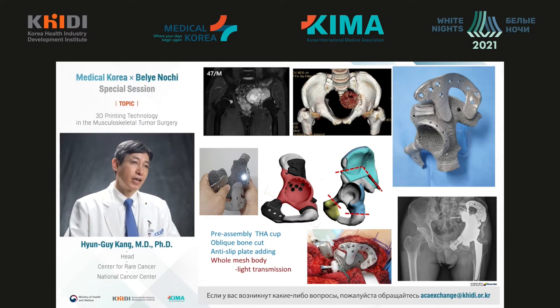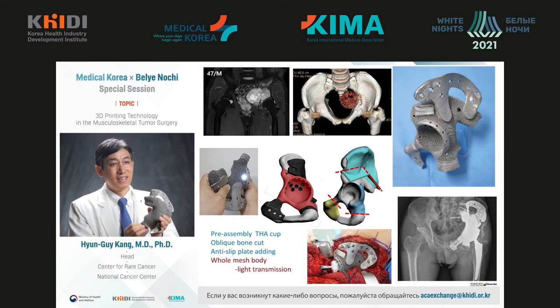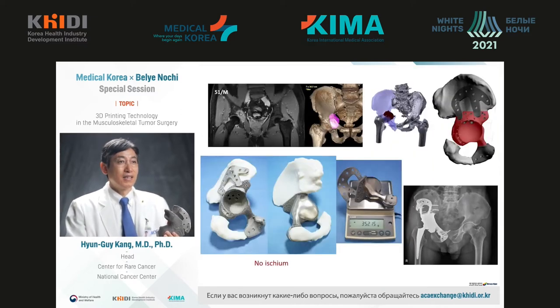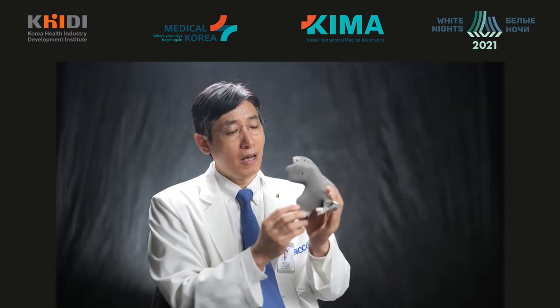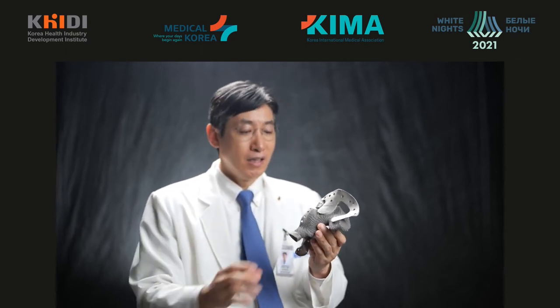Now I would like to show you some examples, starting with the pelvis. A patient, 47 years of age, with left pelvis chondrosarcoma. We printed a 3D implant with a whole mesh body. It should fix the pubic bone and ischial bone. The next patient, 51 years of age, had right pelvis osteosarcoma. After modeling this part of the ischial bone, we found this part doesn't have any load on it. We decreased its weight to 530 grams.